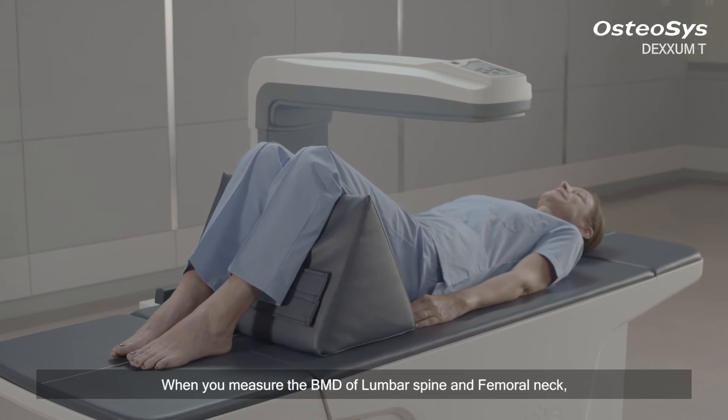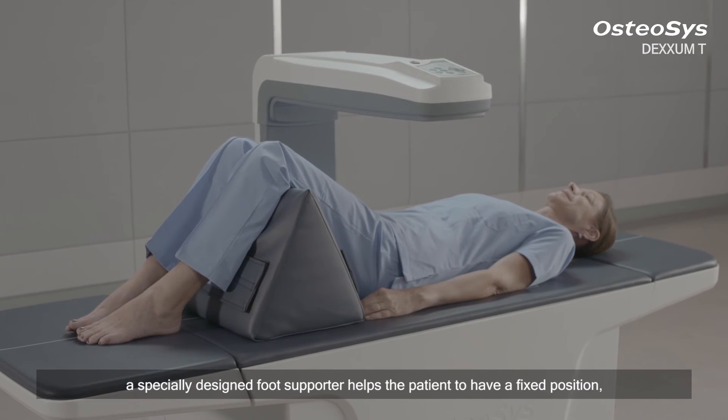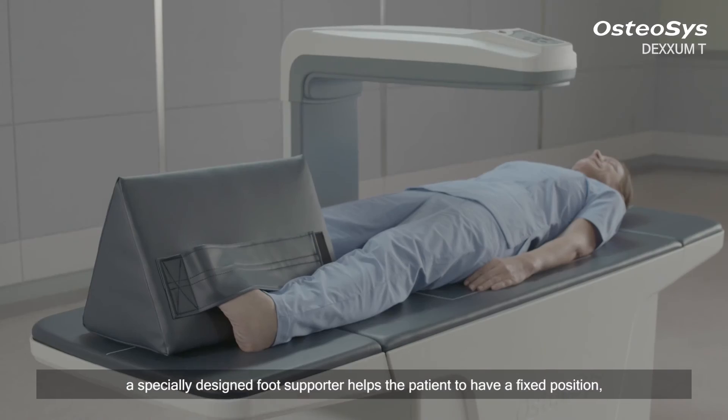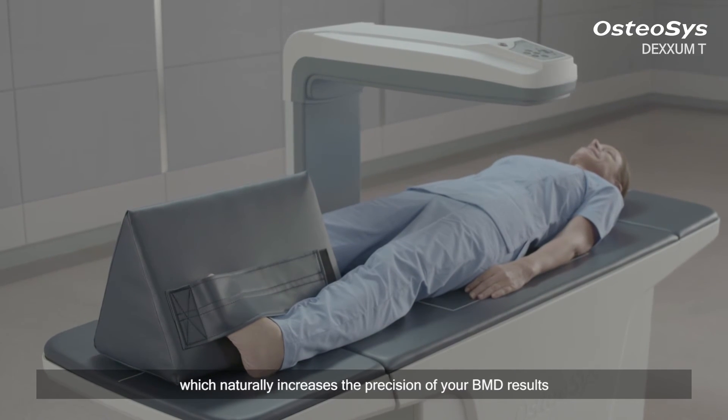When you measure the BMD of lumbar spine and femoral neck, a specially designed foot supporter helps the patient to maintain a fixed position, which naturally increases the precision of your BMD results.